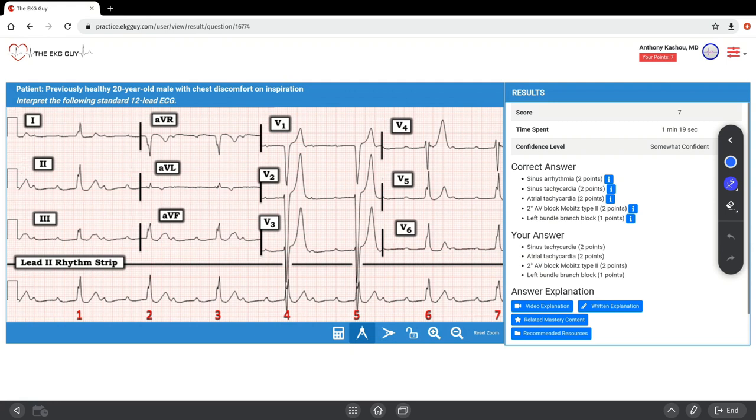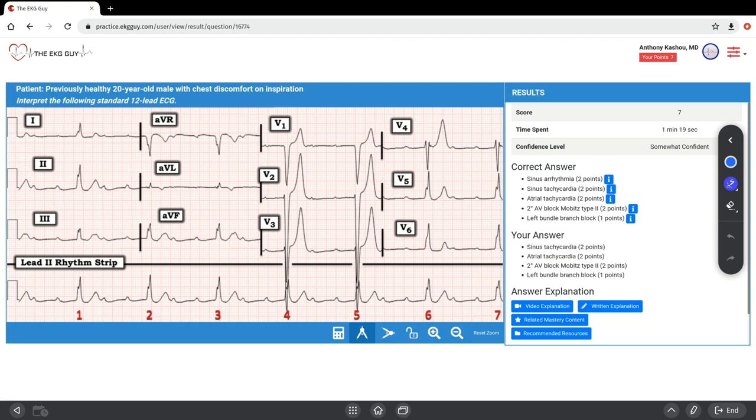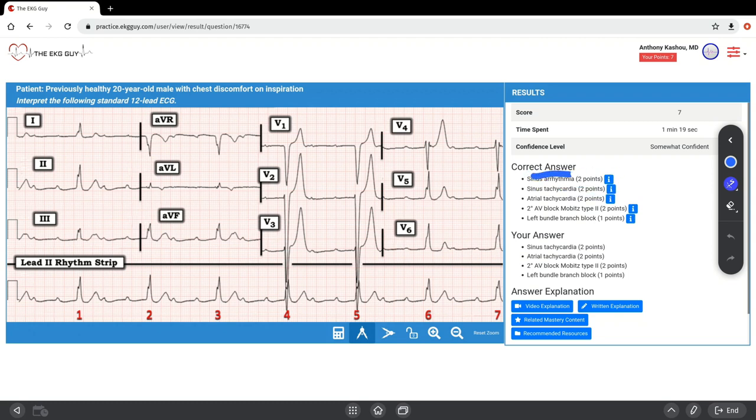This would suggest sinus tachycardia. Note that it's difficult to distinguish between sinus tachycardia and atrial tachycardia. Technically, atrial tachycardia would imply a non-sinus ectopic source of atrial activity, although there's no way to determine this from a single ECG tracing. Atrial tachycardia might be preferred given how fast the atrial rate is. For this reason, we've given credit for both sinus tachycardia and atrial tachycardia. Either one, if you had them both, we understand, and we've given points for each.